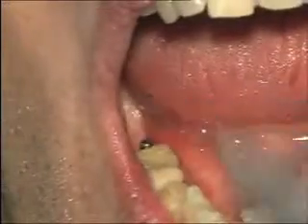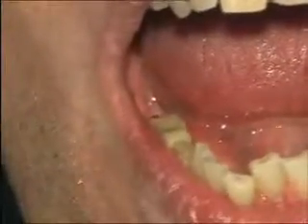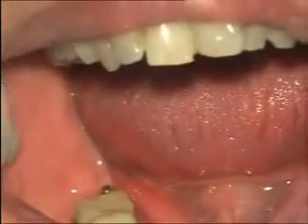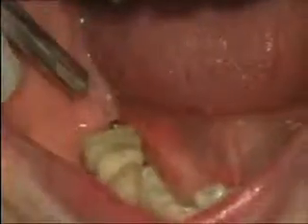Now this abutment cannot be removed. It is finished. We will talk about cold welding — how the technology works. See, there is no anesthesia, there is nothing. Look at the gum looking nice and pink.